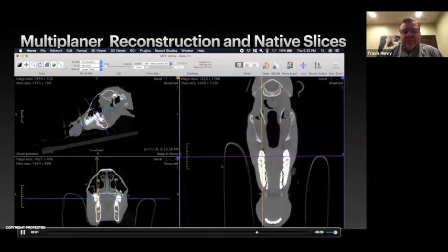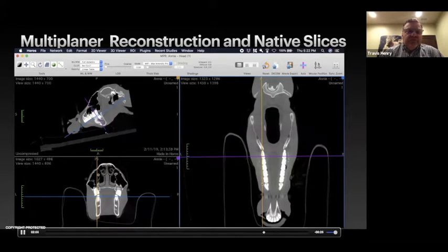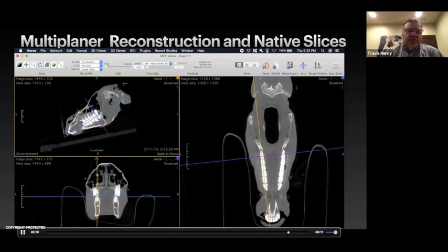that with being able to put this into the multiplanar reconstructs and actually angle this so that we can see up through a tooth on, say, the dorsal plane. And here I'm correcting for even the shape of the mandibles by moving that yellow line so that I can see all of the mandibular teeth when I'm actually evaluating for periodontal disease. So it's a really powerful feature that we can use in CT.